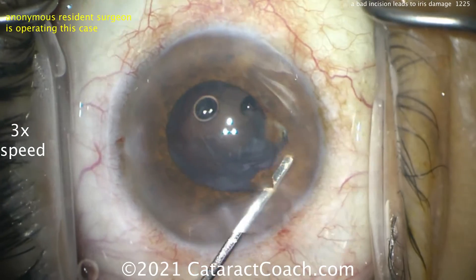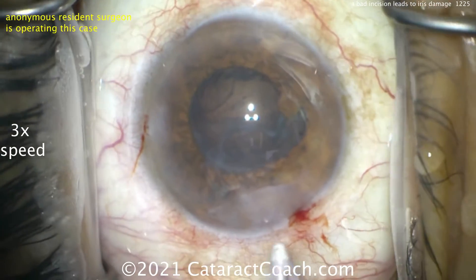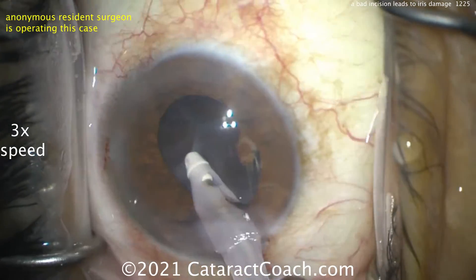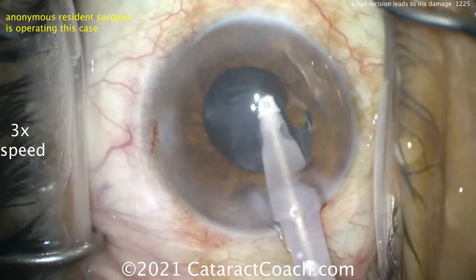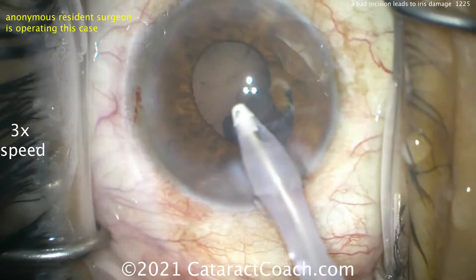Oh boy — remember that can't be undone. Fortunately, this is a very sweet, kind, and forgiving patient who also has a nice dark brown iris, so when you look at the patient at conversation distance, this corectopia or iris defect is not that visible. So that looks pretty good.